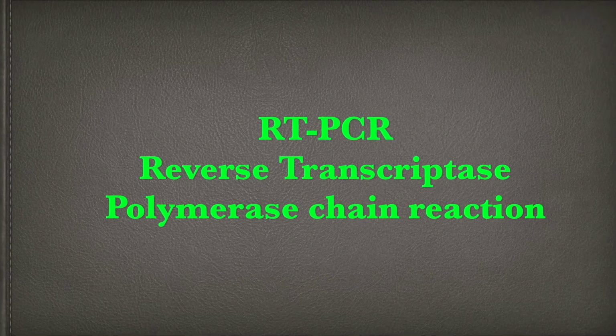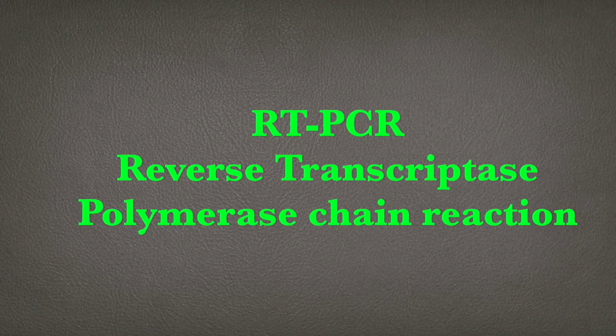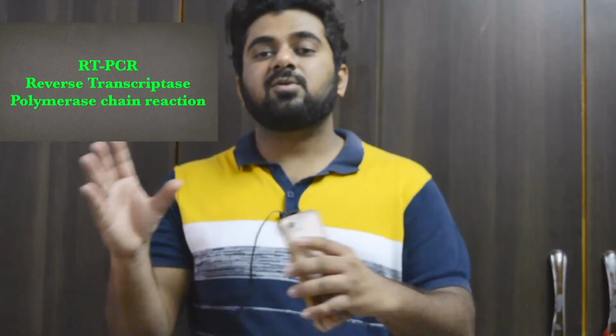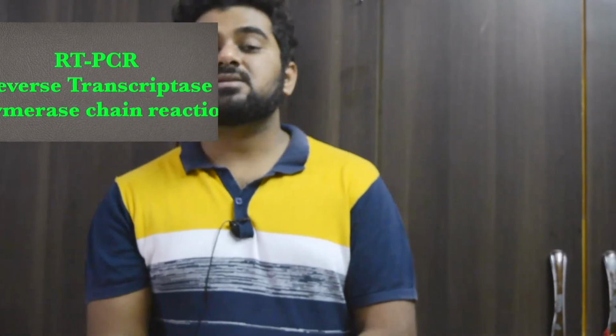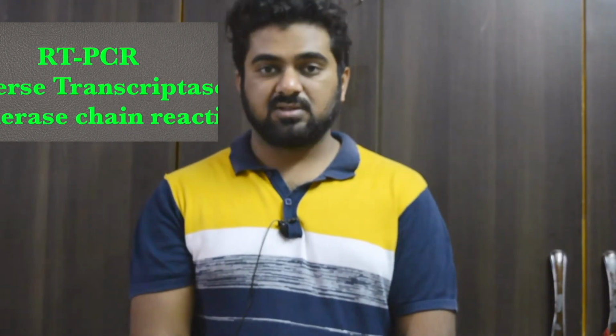Now the PCR technique which is used for COVID-19 is called reverse transcriptase polymerase chain reaction. Now why is it called reverse transcriptase PCR? Because we know that PCR can replicate DNA into more copies, right? But our sample contains RNA. So first we need to convert the RNA into DNA. So it's a reverse process, right? Normally, DNA makes RNA, but here we are converting the RNA into DNA. And the enzyme which is required for that is called reverse transcriptase. So from that, this process is called reverse transcriptase polymerase chain reaction, right?